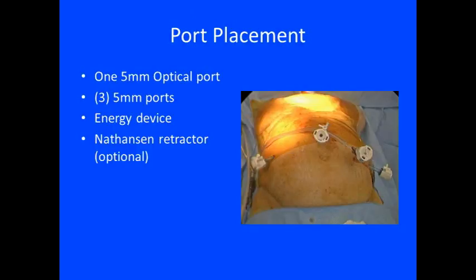Access was initially obtained by using a 5-millimeter optical port in the supraumbilical position, followed by three additional 5-millimeter ports under direct visualization. A Nathanson retractor was subsequently used for liver and greater curvature retraction.